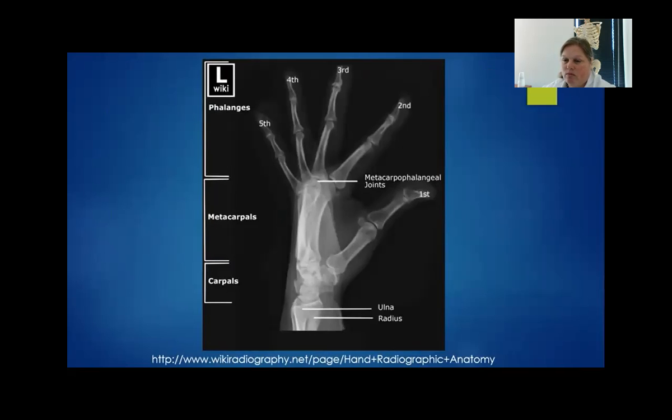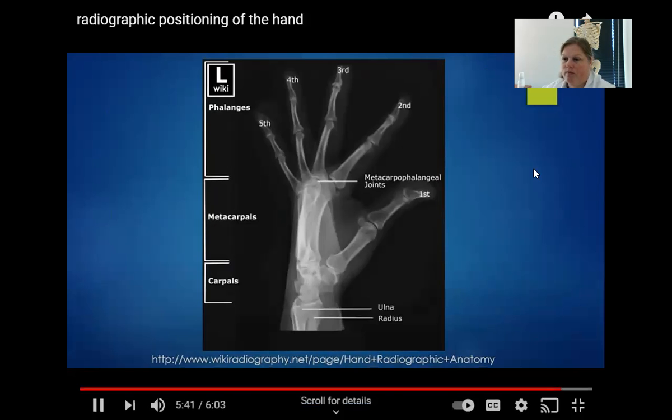So this one's going to hold it, kick back, twist it back, but nicely fanned out. We just have to fix that collimation a little bit so we're not clipping the top of the third digit. That is the end of the hand. So PA, PA oblique, and lateral.